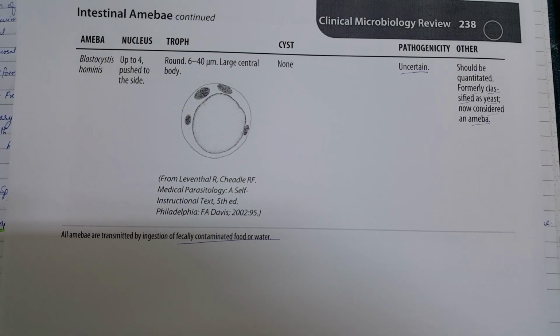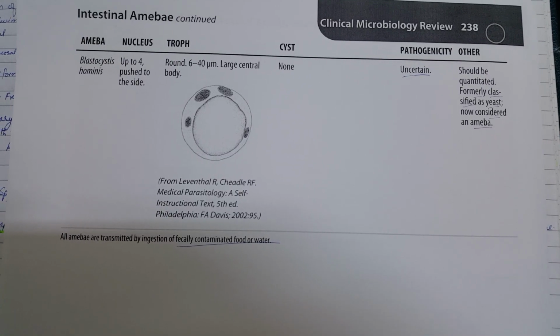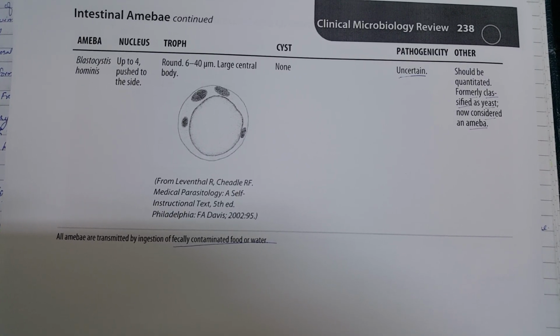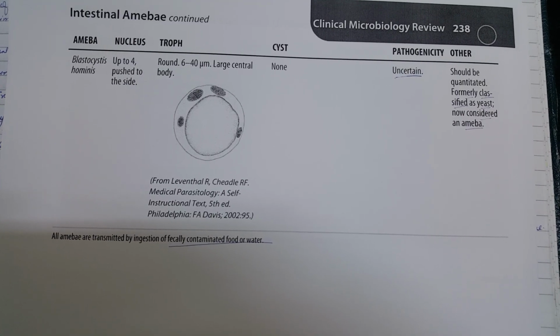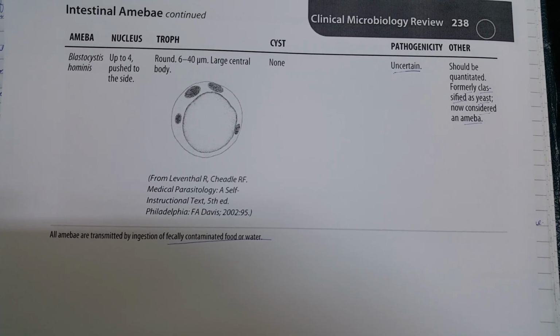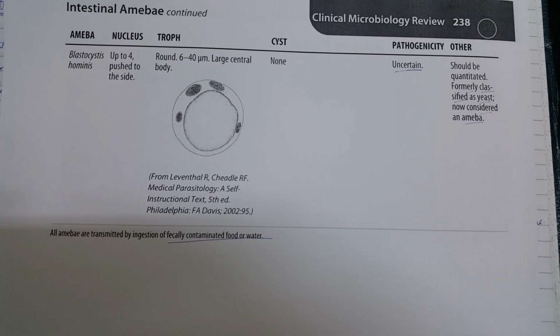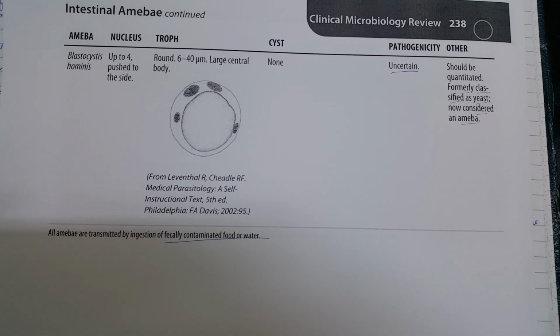The infection of Blastocystis hominis is completely dependent upon the quantitation. If its quantity is moderate to numerous in a particular sample, that indicates infection with Blastocystis hominis, and you also have to correlate with the immunocompromised condition of the patient.